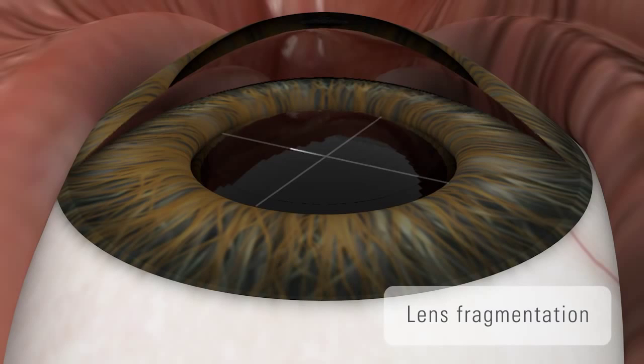The laser pulse energy can always be adjusted, for example, for different cataract grades, thanks to the adaptive pulse management system.